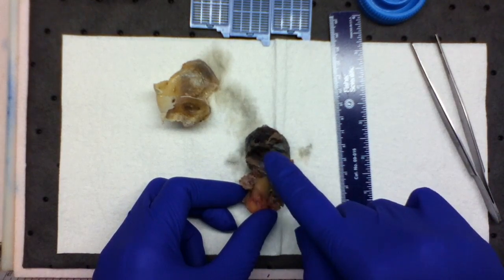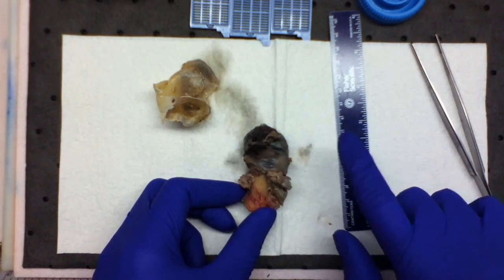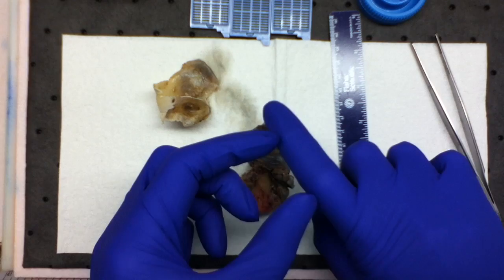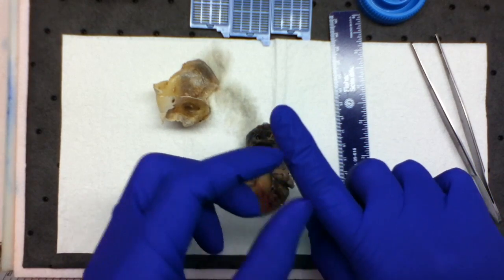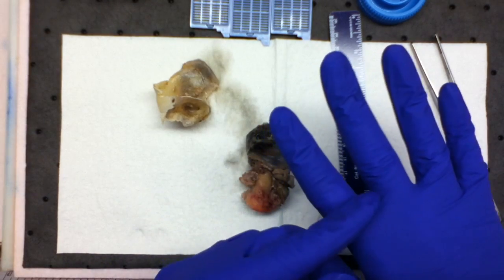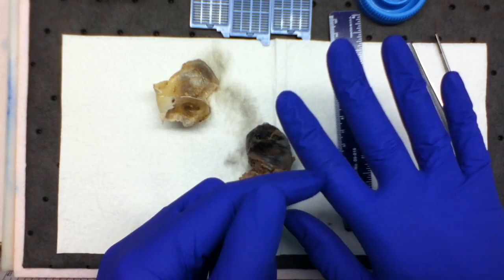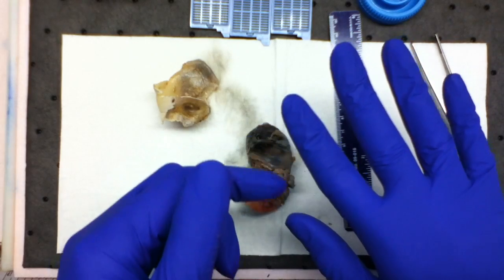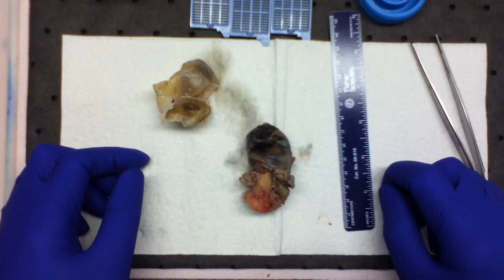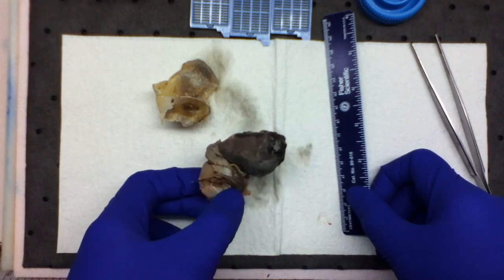Every digit except for the thumb and great toe has two phalangeal joints, the proximal and the distal. Okay, so when you're referring to where it's transected, if you get a toe that's not the first toe, that's before the proximal phalangeal joint, you'll say transected proximal to the proximal interphalangeal joint. It sounds confusing, but it actually will give a little bit more information. Okay, so that's my anatomy lesson. So back to this thing.